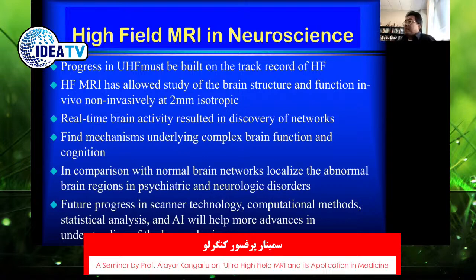Thanks. Yes. So in your question regarding the motion, if I understood correctly, motion in MRI and how it can affect the accuracy and resolution of fMRI. In pulse sequences, you have some parameters, some temporal parameters such as TR and TE, that you can fine-tune in order to suppress motion. There are other ways of suppressing motion, such as navigation techniques.